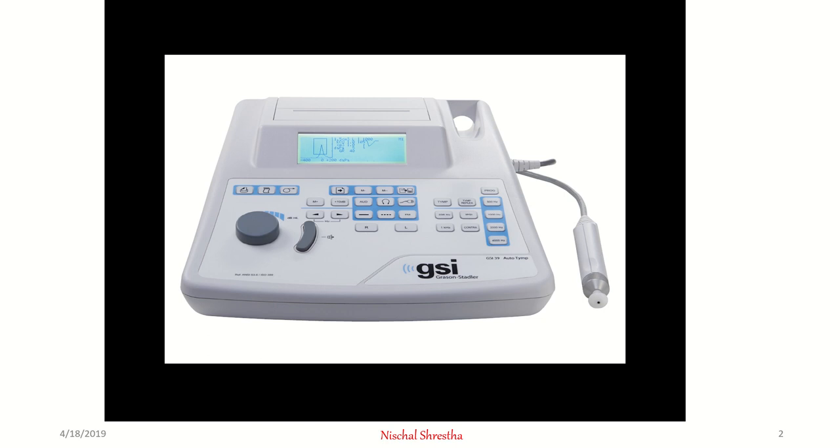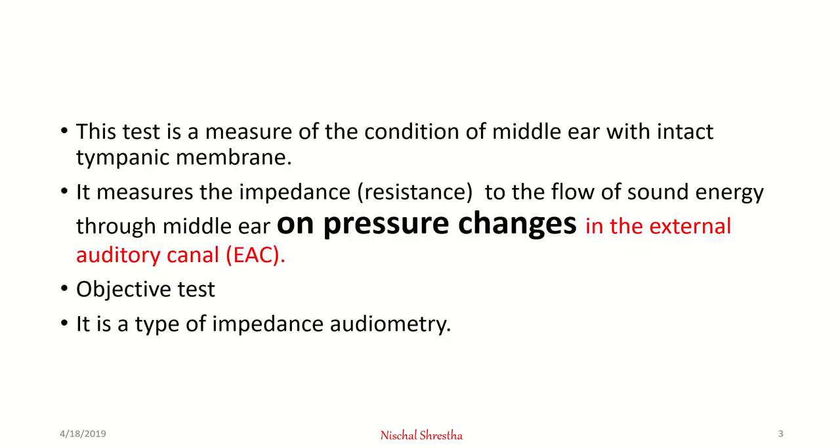In contrast to this, we have PTA, that's pure tone audiometry. We have Rinne test, in which the doctors ask the patient whether the patient can hear the sound or not. So that test is the subjective test, but this one is an objective test.